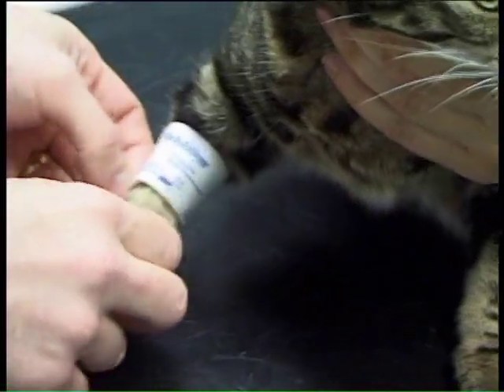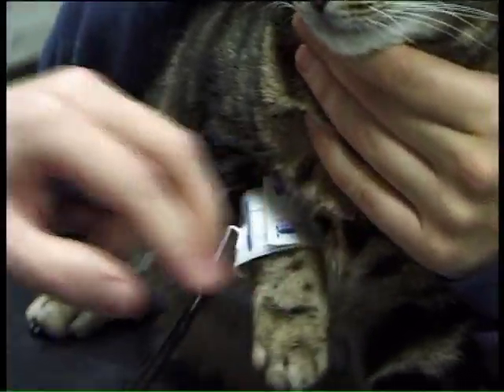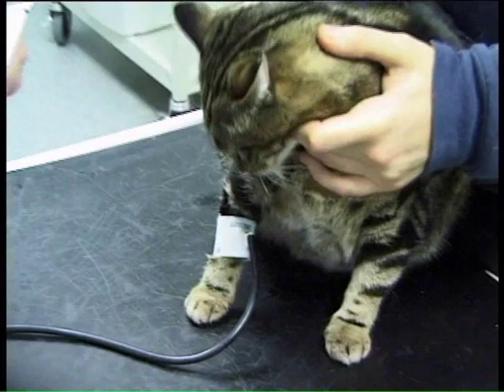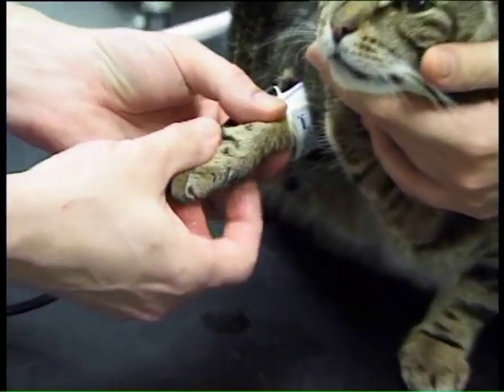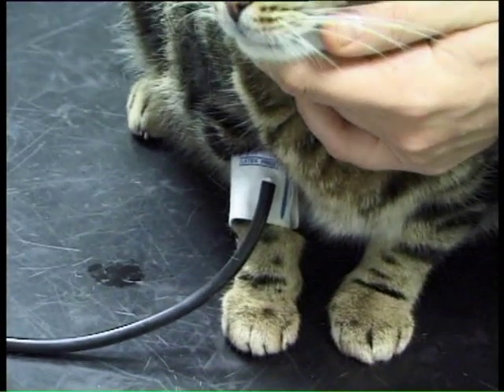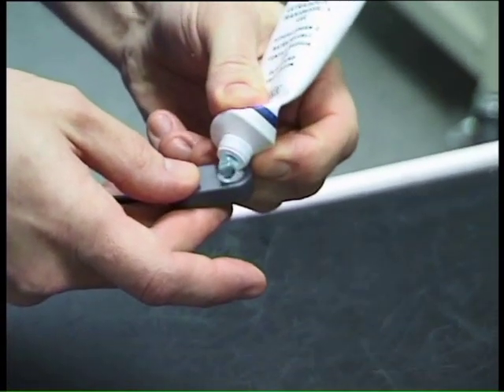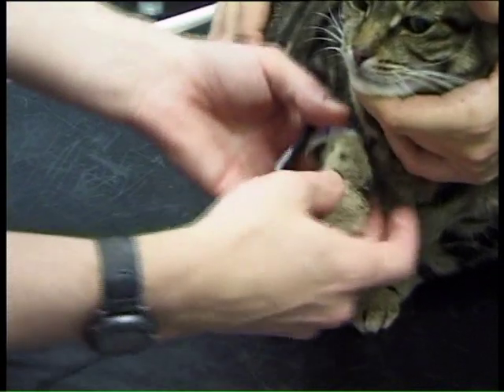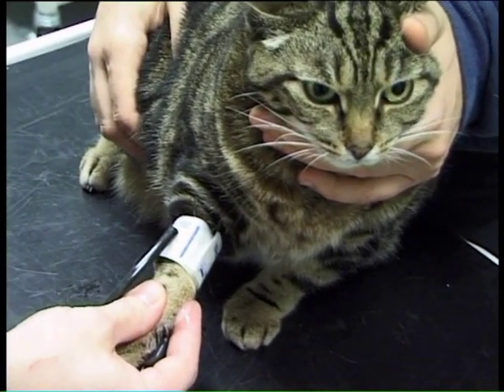Now to get good contact for the Doppler probe, you need to just damp down the fur in that area with some spirit, which is ideal for that. And then we need some ultrasound coupling gel as well. So we normally put some of the gel in that area between the carpal and metacarpal pads, just thoroughly moistening all the hair in between those pads. And then a little bit more ultrasound gel on the probe itself. Then we can place the probe just below the carpal pad, and once that's in place, we can then turn the machine on.